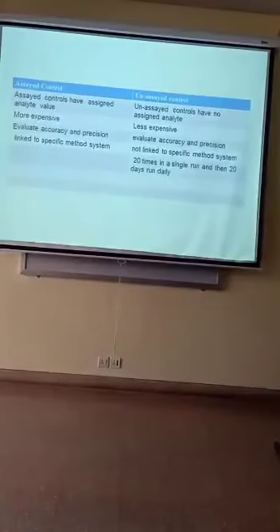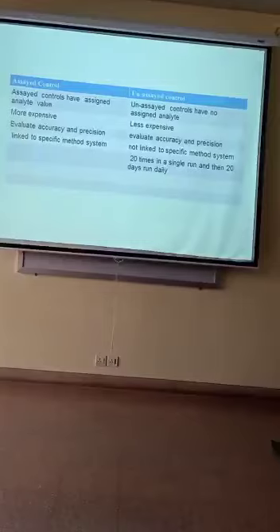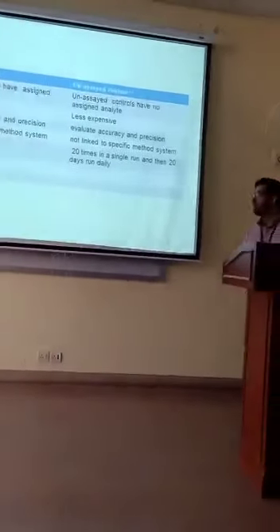So that's why it is more expensive, and it can be used to evaluate accuracy and precision, and it is linked to the specific method system.